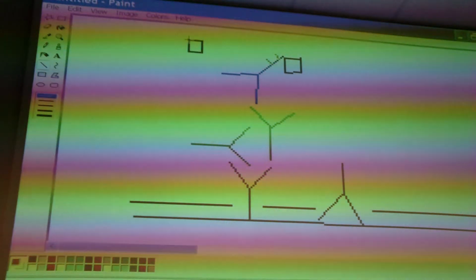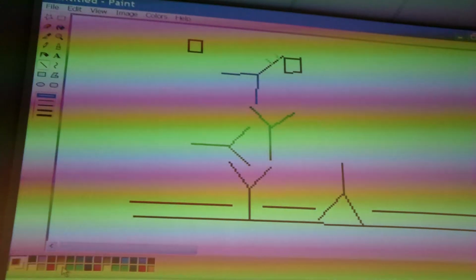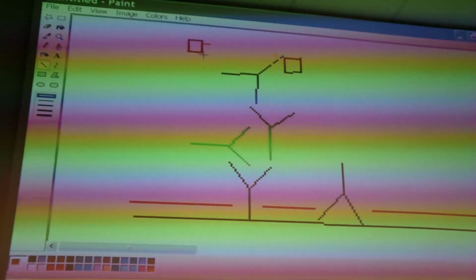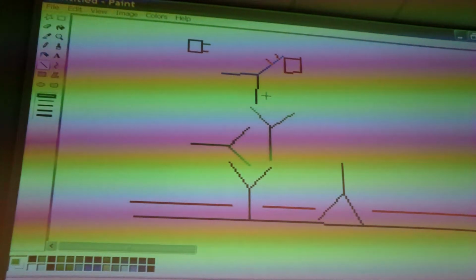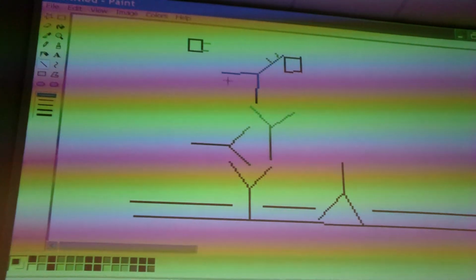So, make it a square. And you would biotinylate that one as well, because you can biotinylate any protein. And the nice property of streptavidin is that it forms a kind of cross.